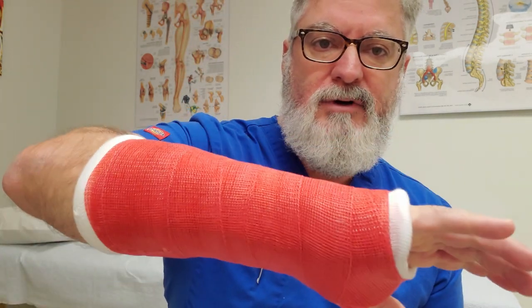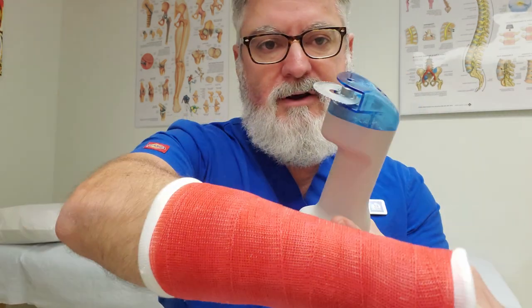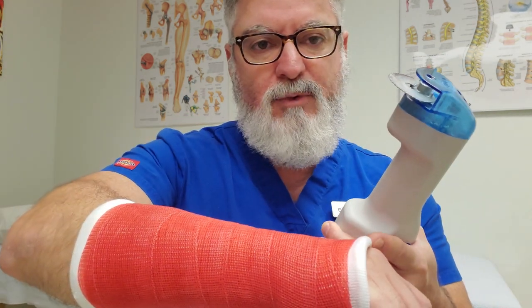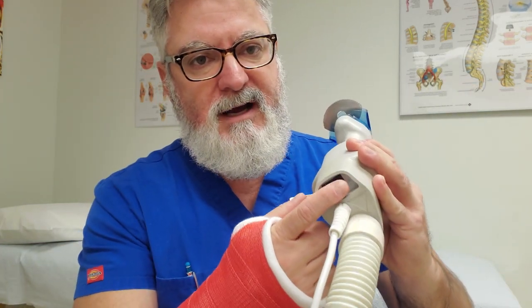So what we're going to do today — this is the cast. We're going to remove a short arm fiberglass cast: two layers of fiberglass, a layer of cotton web roll underneath, and a stockinette. The cast saw is pretty easy to operate. It has two speeds — a low speed and a high speed.